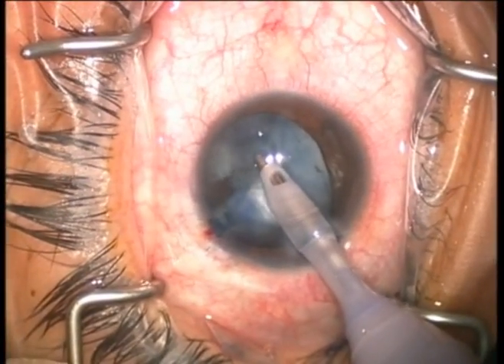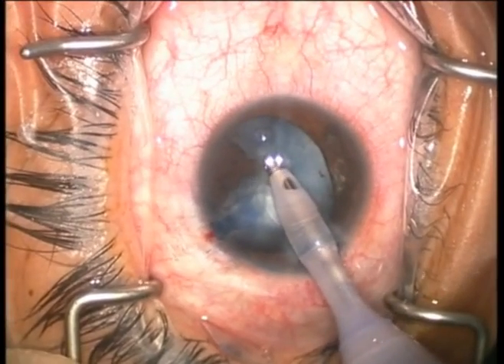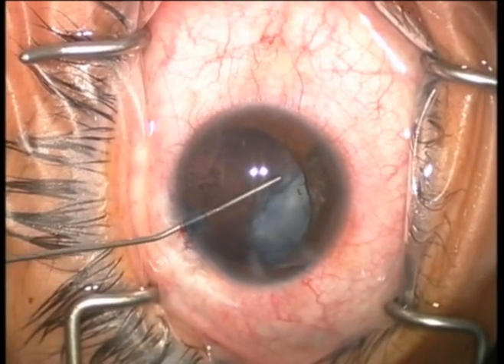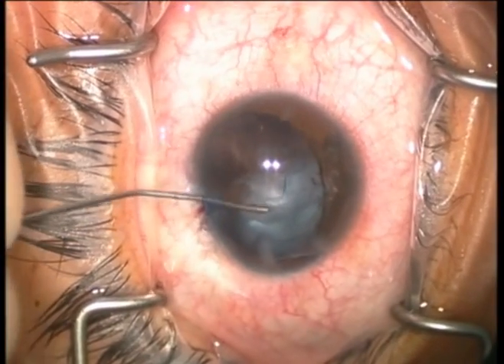Through this round opening, we insert our irrigation aspiration probe to remove the majority of this soft, liquidy, milky cataract. At this time, we'll go ahead and inject our viscoelastic inside the capsular bag to stabilize it.